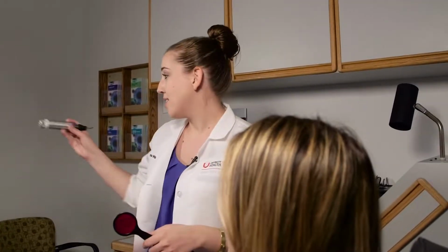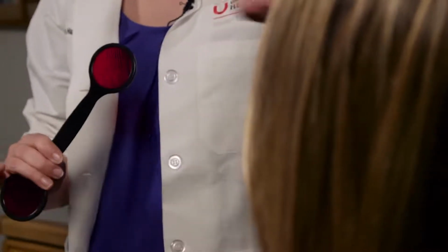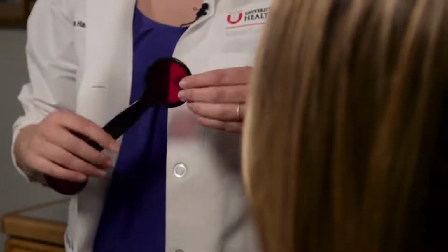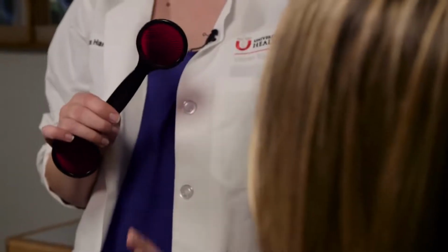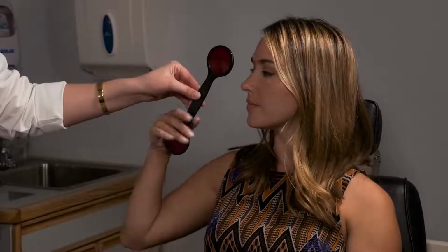For the next test, we're going to do the Maddox rod. I have an assistant here. The Maddox rod is a series of cylinders, and you can have the patient orient them vertically, which will give you a horizontal red line, or you can have them oriented horizontally, which gives a vertical red line. The idea is that you give the eyes two very dissimilar images, and so you can very precisely measure the deviation. So let me have you hold that up over the right eye, and you have your assistant hold a muscle light down at the end of the room.